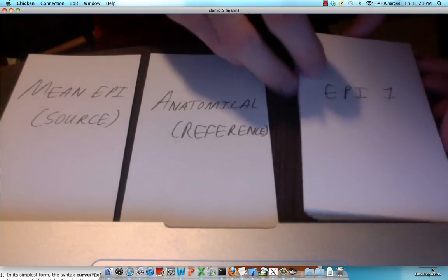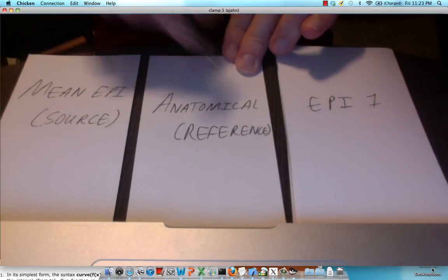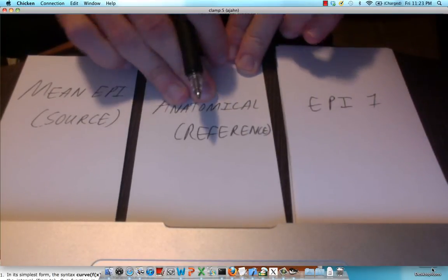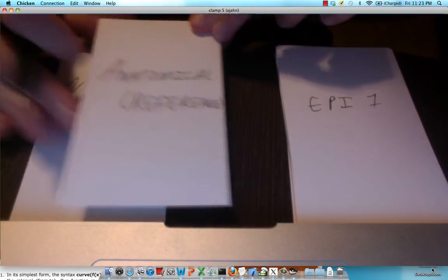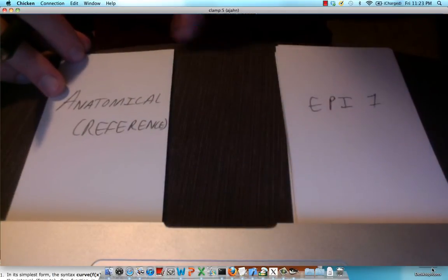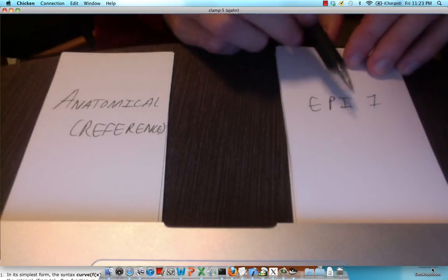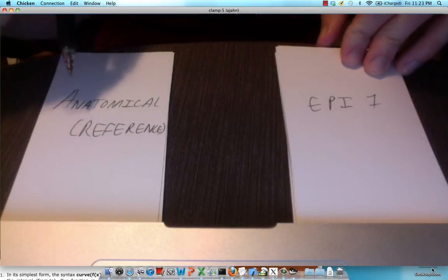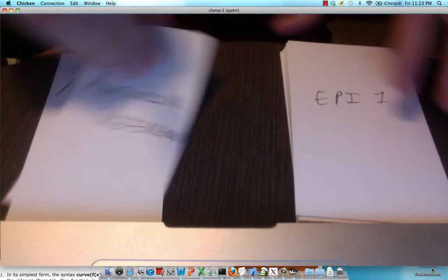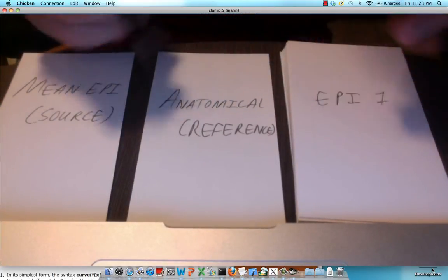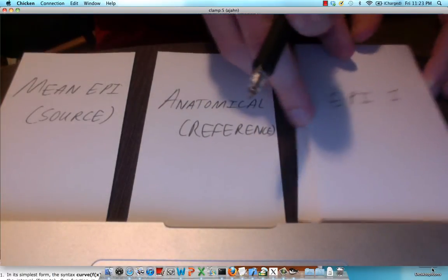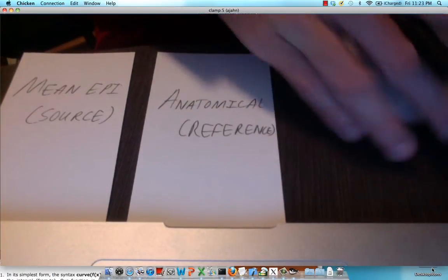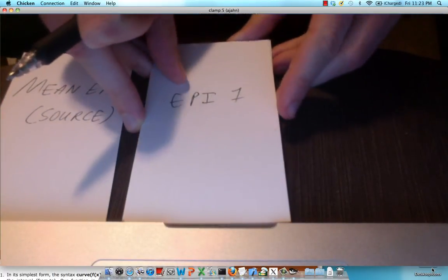So first what we're going to do is we are going to co-register this anatomical image to this mean EPI. So this anatomical image actually gets moved around and is aligned on top of this mean EPI. Once that's done, these other EPI images right here are aligned to this anatomical reference image. Now this one has all the motion and transformation parameters that needs to be aligned and those are also going to be applied to these so that they are in alignment with the anatomical image.